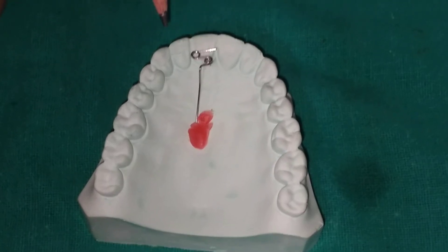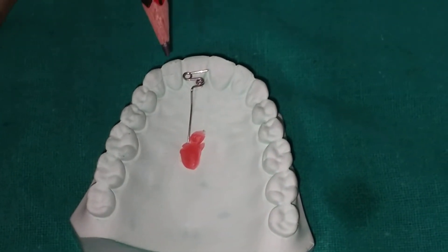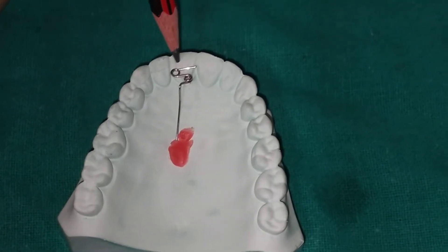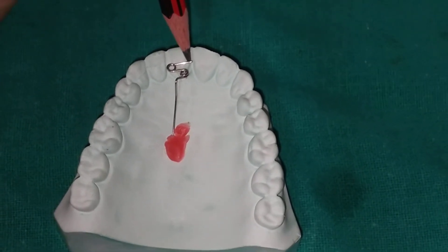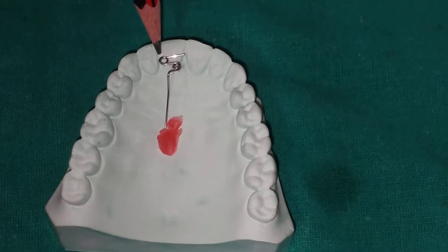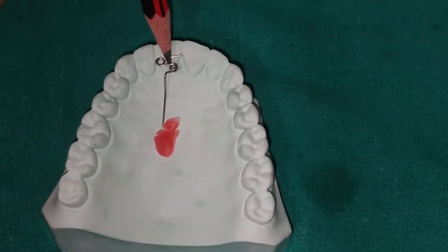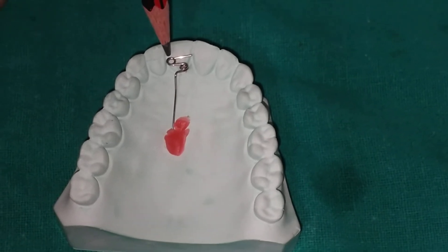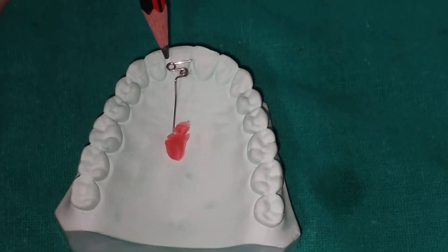This is a completely fabricated Z spring. It is called a double cantilever because one arm from the first helix is one cantilever, and the other arm from the second helix is the second cantilever. For its activation, we open both the helices.